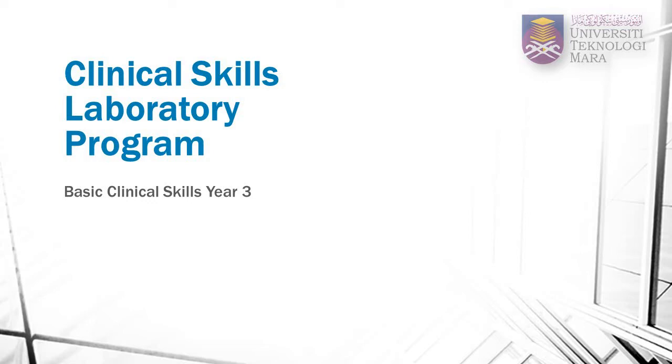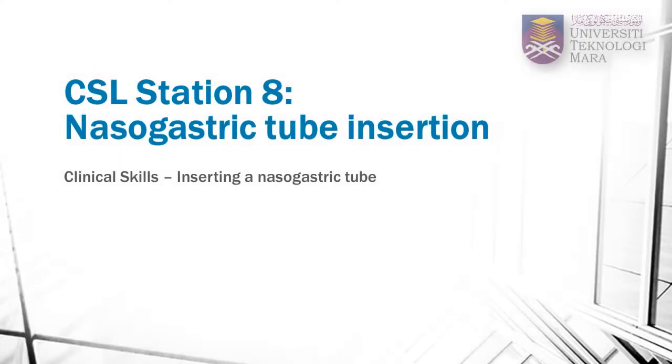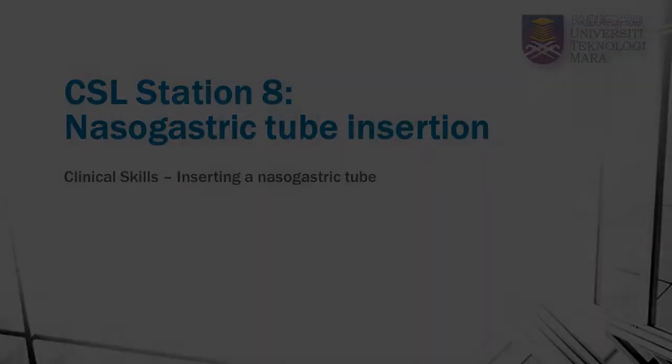Welcome to UITM Clinical Skills Program. This is Clinical Station 8: Nasogastric Tube Insertion. In this video, you will learn the technique of inserting a nasogastric tube using a mannequin instead of a real patient for learning purposes.